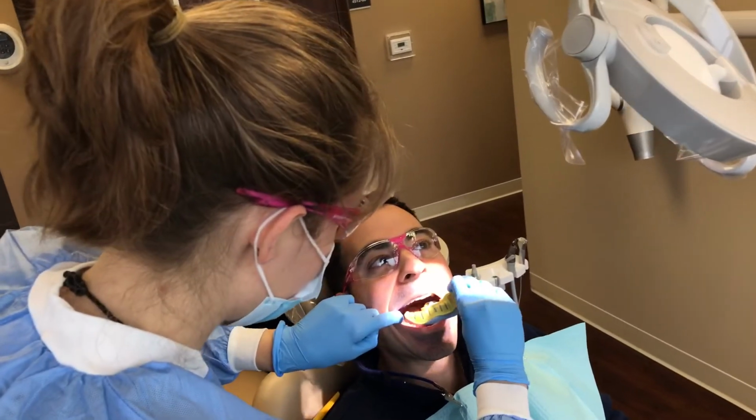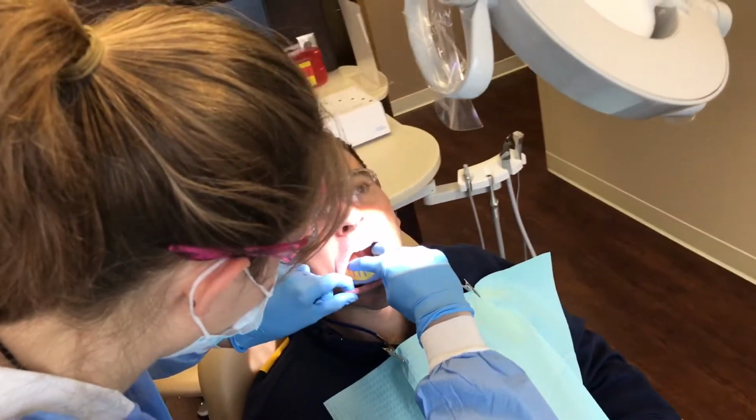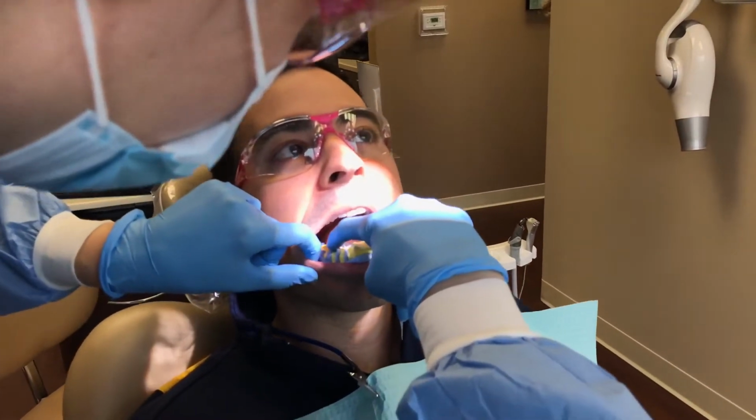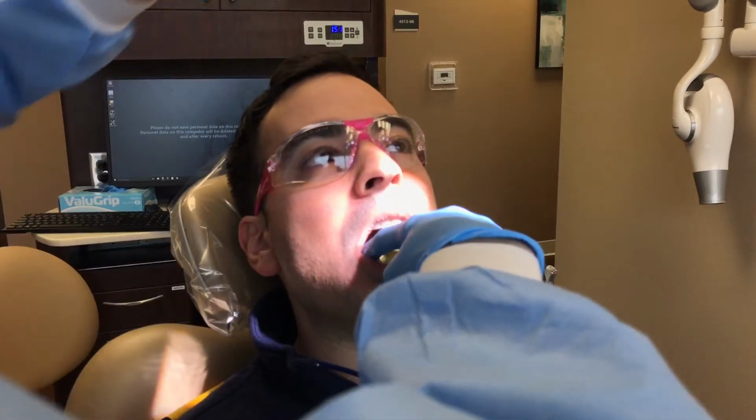It's great if you can have your assistant or the patient dry the mouth. Stick your tongue out for me. Okay, and then we are going to seat that tray. And stick your tongue left and right, and then relax your tongue for me.